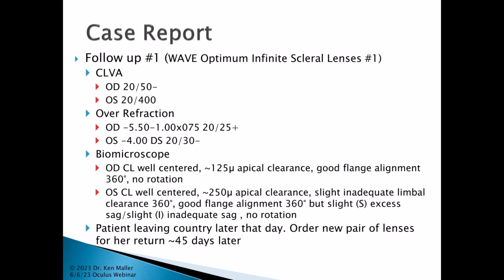She also did comment she was shocked about how much she didn't experience any pain. In fact, she didn't even know the lenses were on her eyes when I had them on her. So it was a very, very good first pair of lenses.